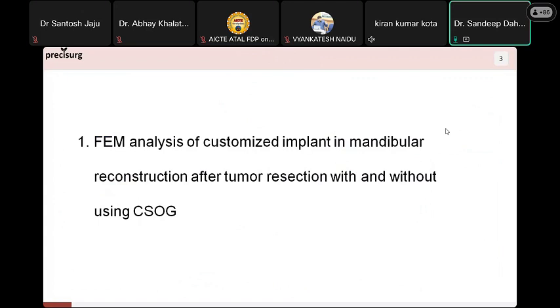After completion of the surgery, we also took the follow-up of the patient after 1 month, 2 months, 6 months, 11 months, and 24 months. Because this implant is uncemented type, we have not used any cement while fixing this implant into the patient's body. So you can see up to the result of 24 months, the implant has slightly changed its position from the original one.